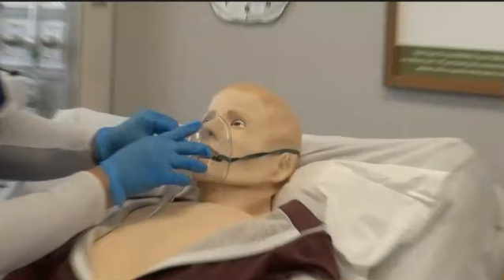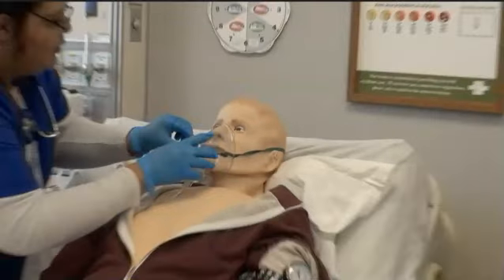Prior to providing the nebulizer to the patient, she looked for aerosol coming out. That's what the pause was between the flow meter and putting it onto the patient. Notice how she communicates the appropriate next steps with the patient.